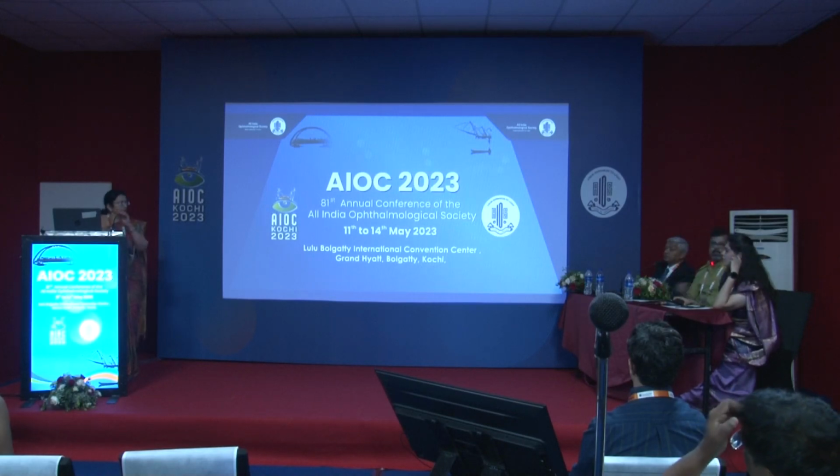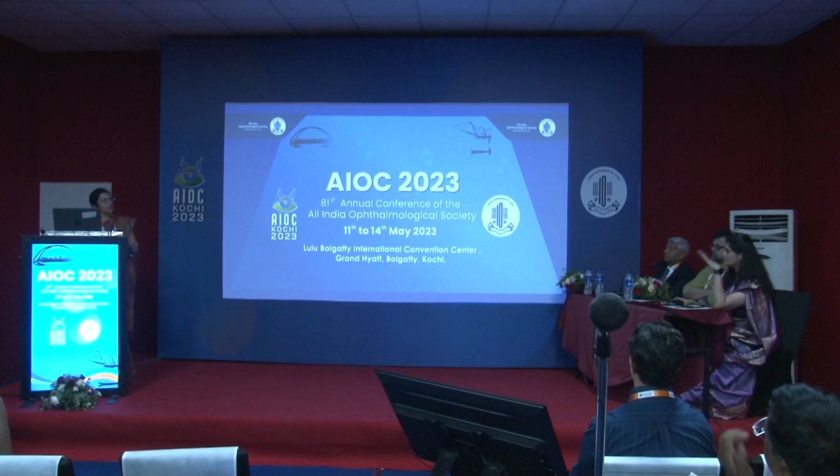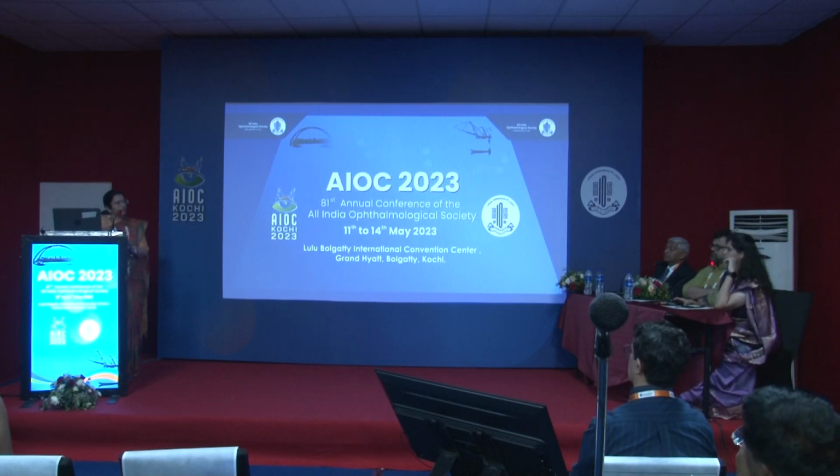Thanks. And I wanted to know how often you calibrate your IOL Master. You were mentioning calibration of instruments. In routine practice, do you really calibrate the IOL Master very often, or is it not required? That is done by the optometrist. Actually, it's not required very often, but I think they are doing it once in 6 months or so.